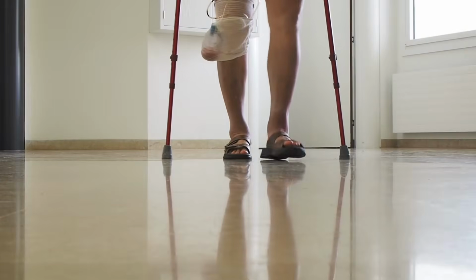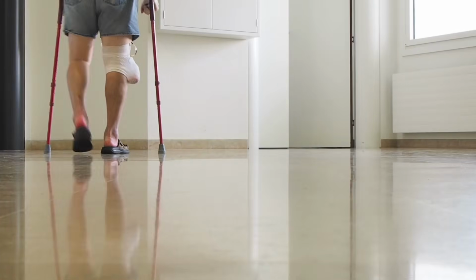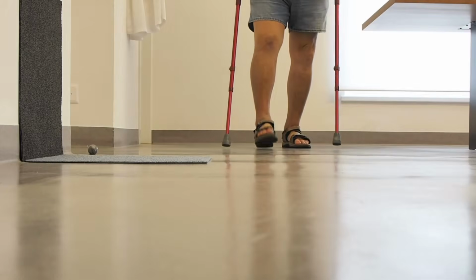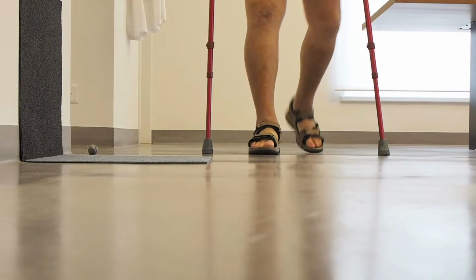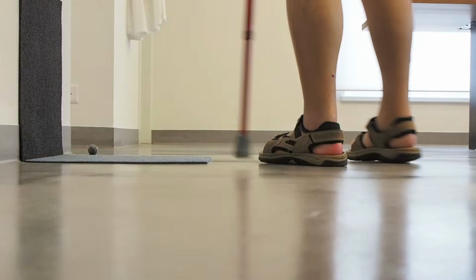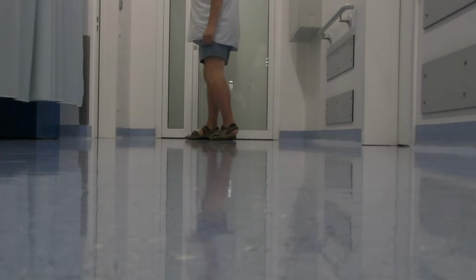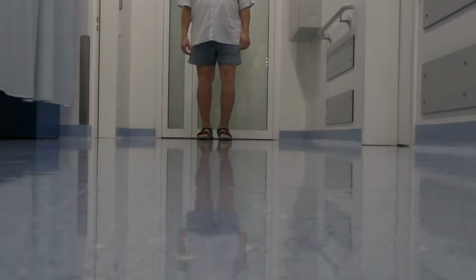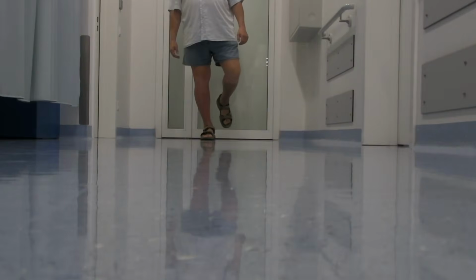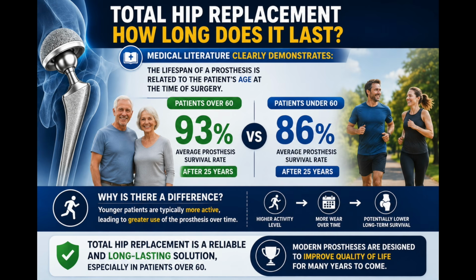Here we are on the second day after surgery, even before the removal of the drain that you see secured to the right leg with elastic gauze. You can now see the same patient in the office at 2 weeks using the 2 crutches only for safety and not because he really felt the need. Finally, here we are at the checkup 1 month after the operation. At this point, walking appears fluid and unimpaired, and the patient is able to maintain balance by leaning on the operated leg. Many patients rightly ask how long a prosthesis will last.